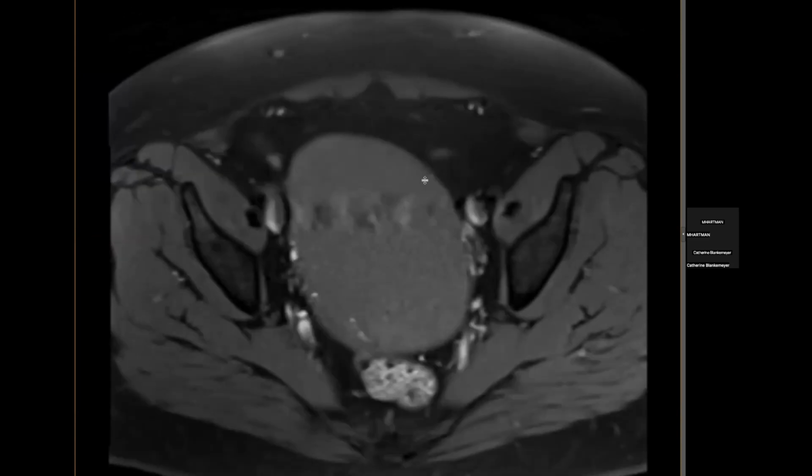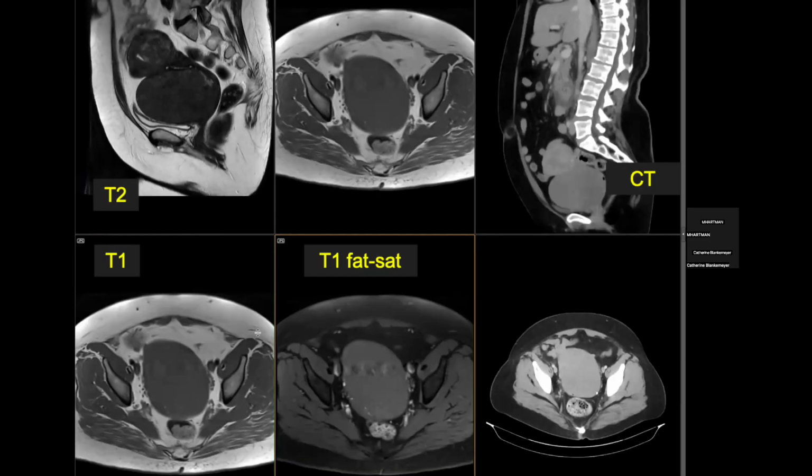This is going to be very helpful when we have fatty lesions such as teratomas. They will be bright on the regular T1. You give them the instant liposuction with the fat sat, which can either be on T1 or T2, and it will go from bright to hypointense. You have just diagnosed macroscopic fat, and that's one way we diagnose dermoids. So we'll have that in another lecture.